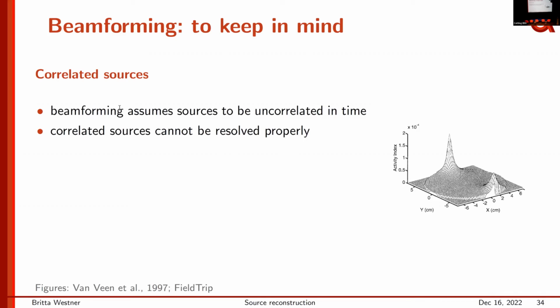And now if you move them very close, you would again blur between them, maybe a bit around them, as you can see here, but that would still reflect what you assume of your true activity to have looked like anyway, because if it was extreme, just one pyramidal cell being active, you wouldn't have seen it to begin with.